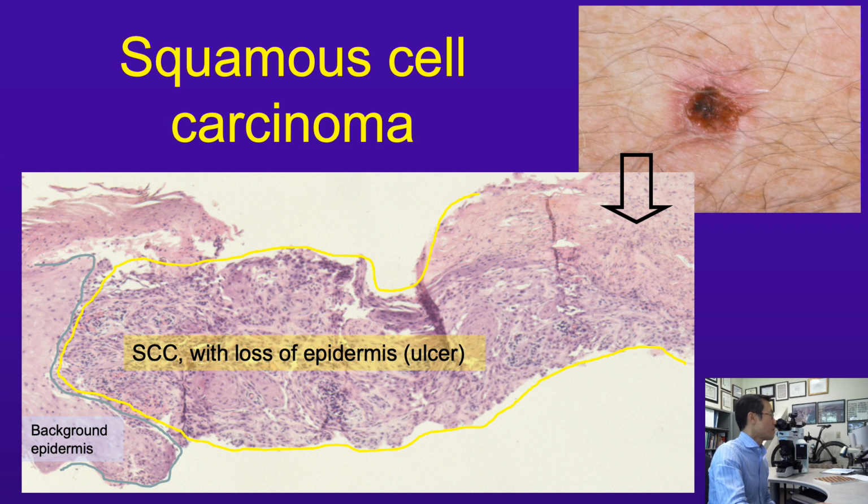We also do have parakeratosis here, which we talked about having a distinctive pattern in actinic keratosis. I didn't really say much about it in Bowen's disease. It's a variable feature in Bowen's disease, but sometimes, as in the previous image, if you want to go back, the absence of parakeratosis in the presence of significant atypia can actually be an indirect clue to Bowen's disease as well.